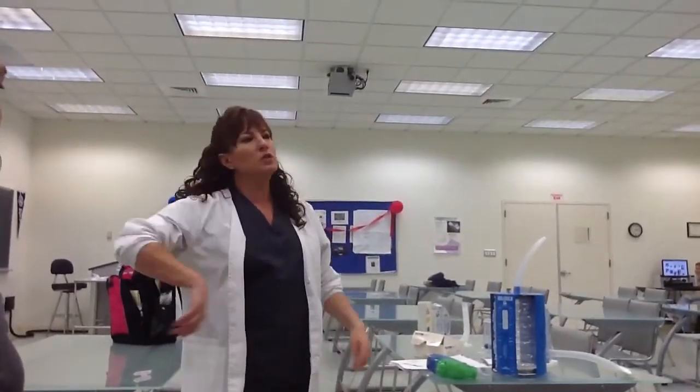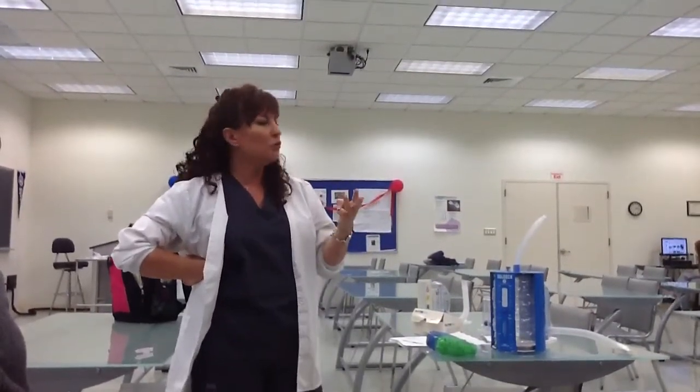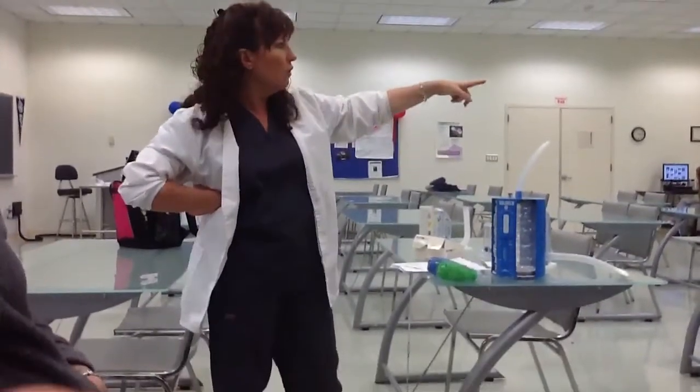Part of the most difficult part of it is: one, you want to have good sound. Two, positioning the patient properly. And three, learning how to manage the bed and actually being able to get the bed into Trendelenburg. So let's go over here.